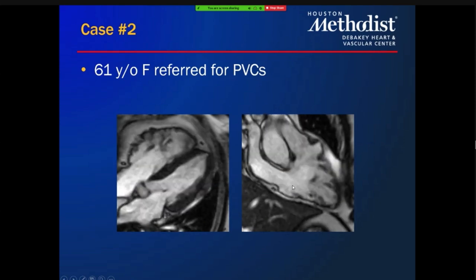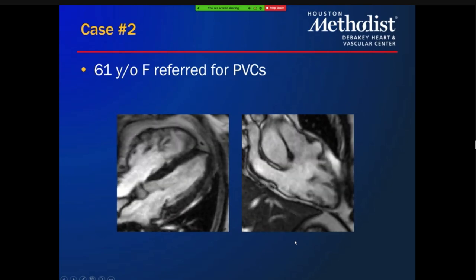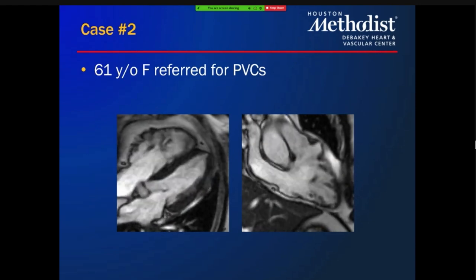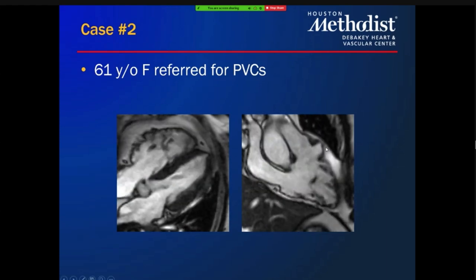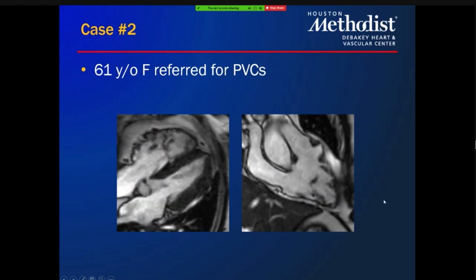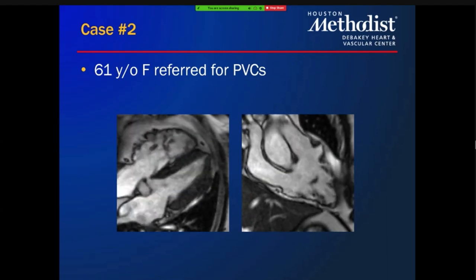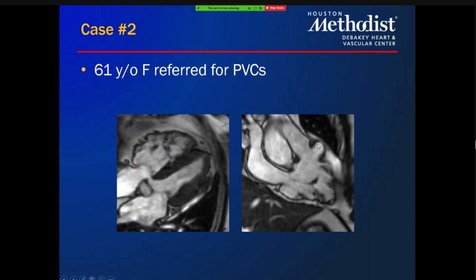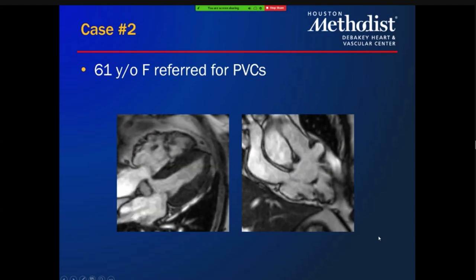And then, Amr, what do you think of the anterior RV? So the anterior RV also does have a hypokinesia actually. What about this? You see my mouse? Is that a dyskinetic segment of the RV? Exactly. Yes, dyskinesia. Remember, we had a discussion the other day about hypokinesis, akinesis, and dyskinesia. You really see when the RV is contracted in systole, this portion actually gets bigger compared to diastole. Correct. So this is true RV dyskinesia. Perfect. Thanks.